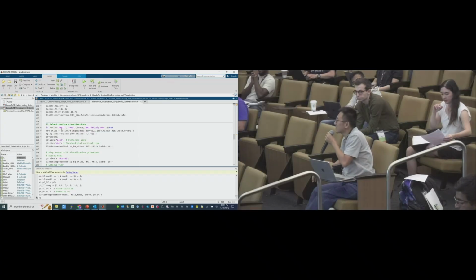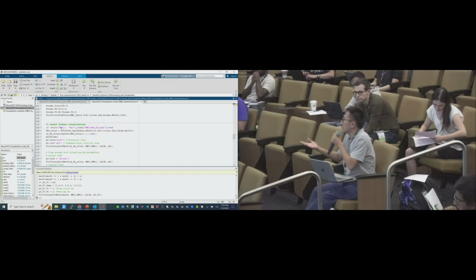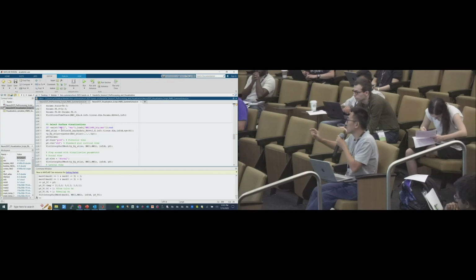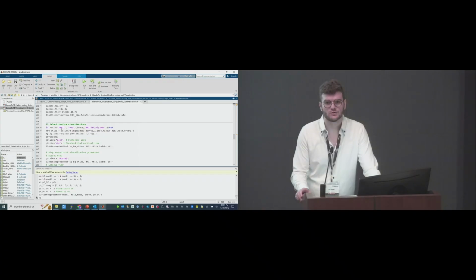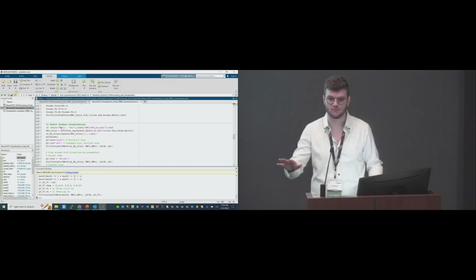Sorry, another question. FreeSurfer has different regions, but the fNIRS data can't really go that deep. So what you're doing with FreeSurfer is creating two outputs. You're creating a mesh output, something that you can project onto, and you're also creating a volume output. Both of those are independent from your NIRS data itself.